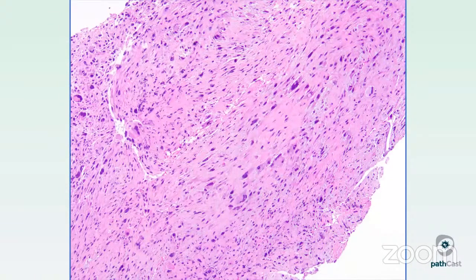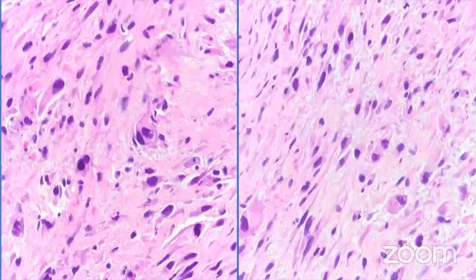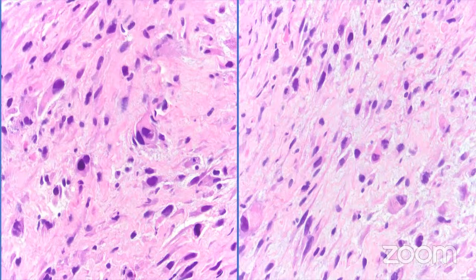Morphologically, they resemble a high-grade pleomorphic sarcoma, essentially, with highly atypical cells, some showing polygonal, spindle, and round morphology with eccentric nuclei, brightly eosinophilic, granular cytoplasm. With a closer look, they can have somewhat of a gangliocytic look to them.